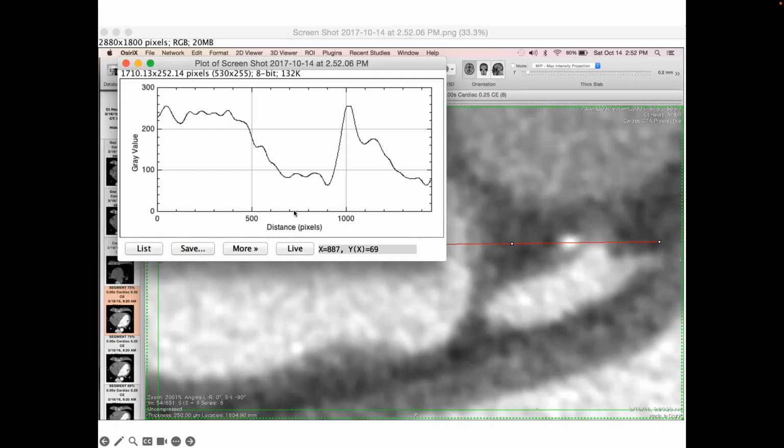This is the left main coronary artery, and it comes into the plane here and then goes out of the plane there. So it's just in the imaging plane for a brief section. So you can measure the dimension of it. And this is a little chip of calcium that's inside the vessel wall, the left main wall, right? That indicates that there was some kind of injury and then repair to that vessel.